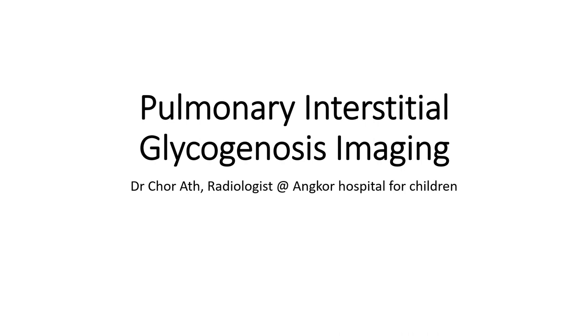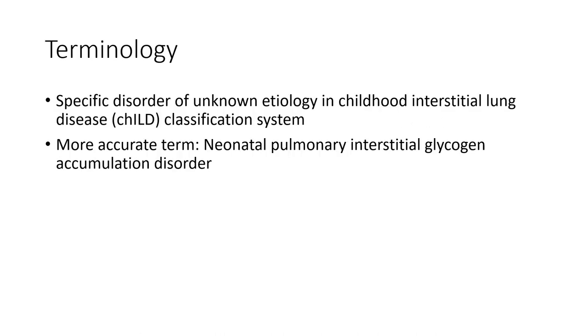Hello everyone, today I'm going to show you pulmonary interstitial glycogenosis imaging. Terminology: a specific disorder of unknown etiology in the childhood interstitial lung disease classification system.